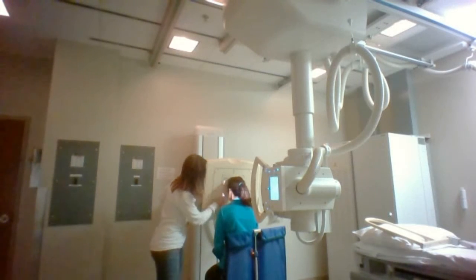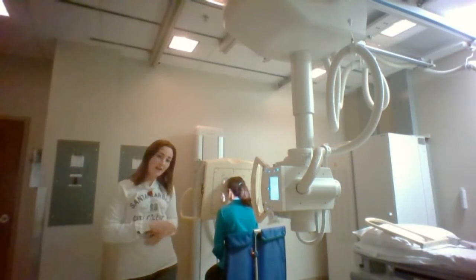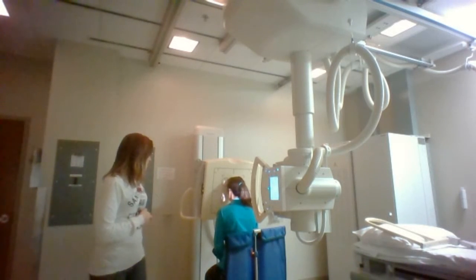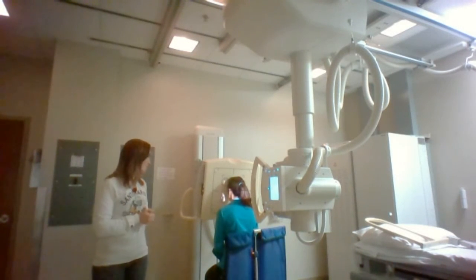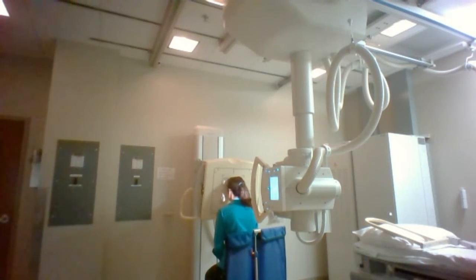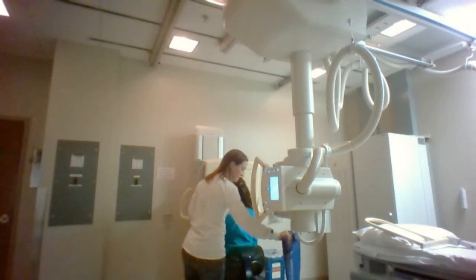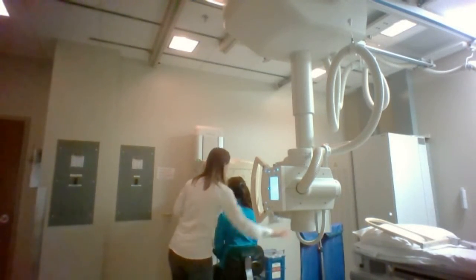Right there in the corner. And I would be using a technique of about 85 kVp at about 7 mAs. So Sky, I want you to hold your breath and don't move. Expose.